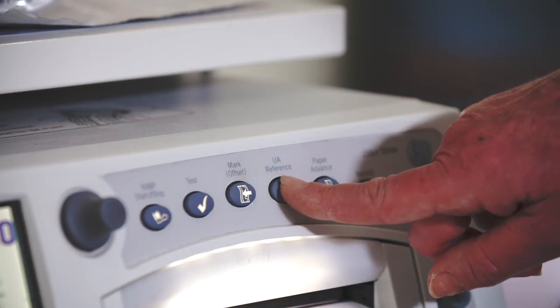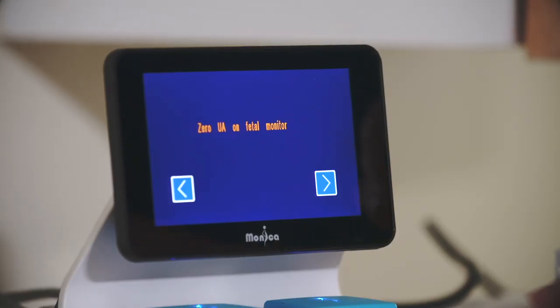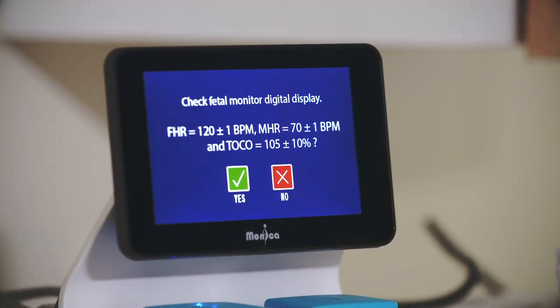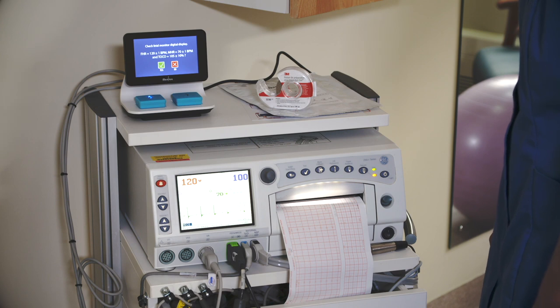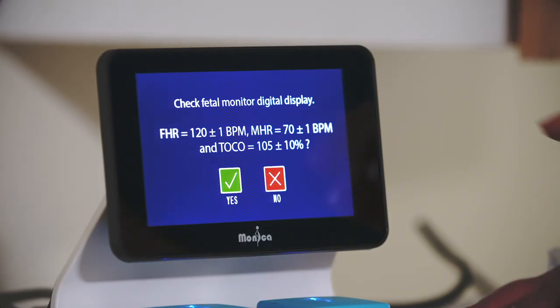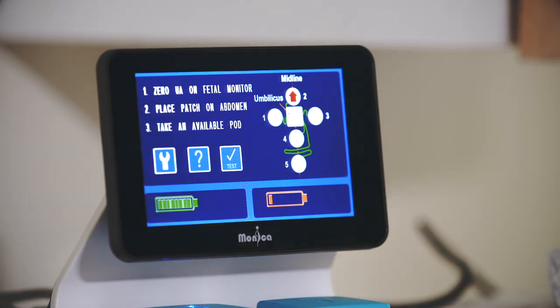When you press the test button, you will be asked to zero the UA reference button on the monitor. Confirm that this has been done by pressing the forward arrow button. Novi will now send an FHR, MHR, and UA signal to the fetal monitor. Check that the fetal monitor displays the test values as shown on the Novi display screen. If correct, press the green Yes button, returning Novi back to the start screen. If you do not see the correct FHR, MHR, and UA values, press the red No button and follow the instructions.